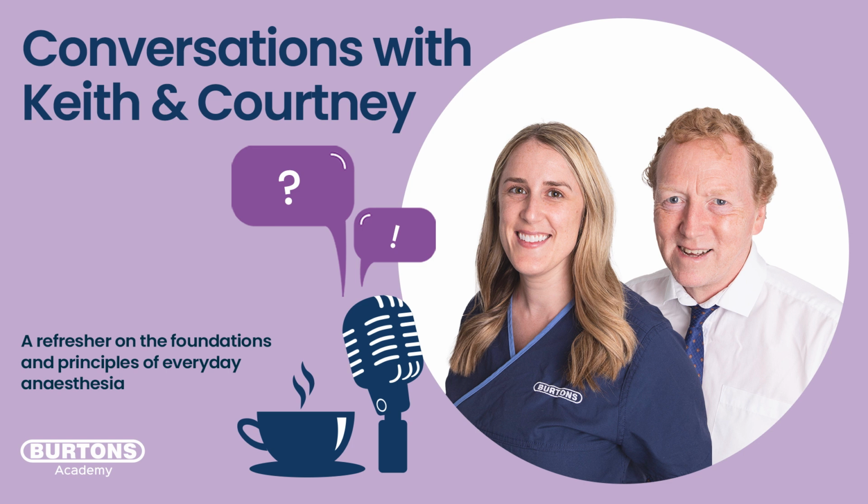I think if in doubt, same thing with capnography, isn't it? And our pulse ox, they're non-invasive ways of measuring these things. Then if in doubt, we can take a blood gas sample, if that's available to our practice, and actually confirm what our readings actually are.